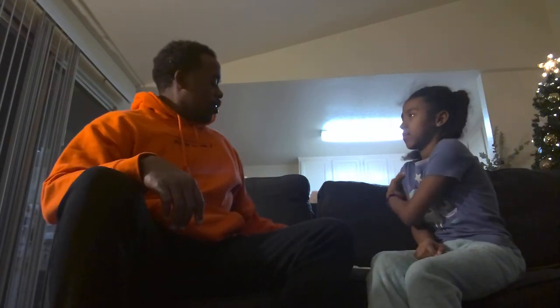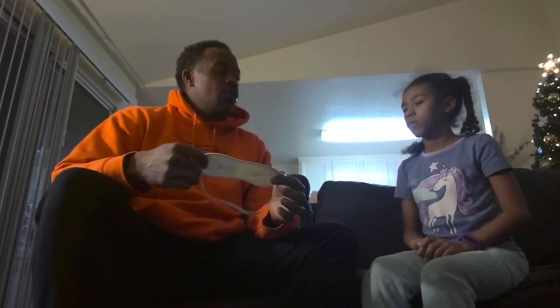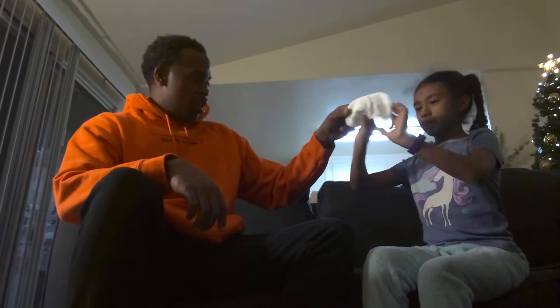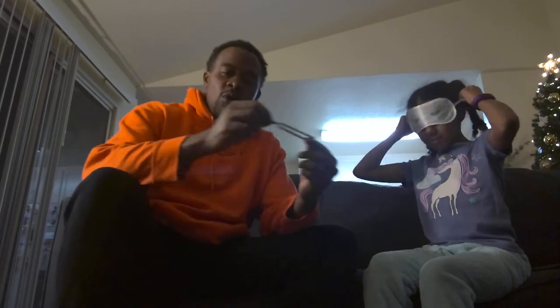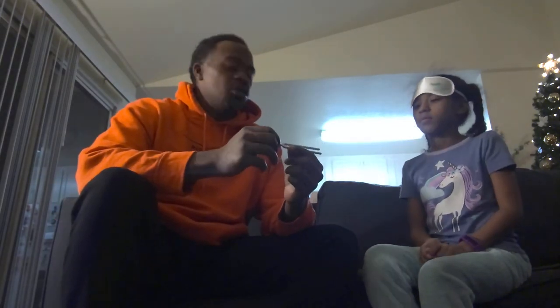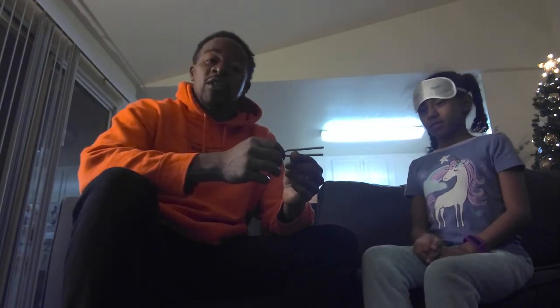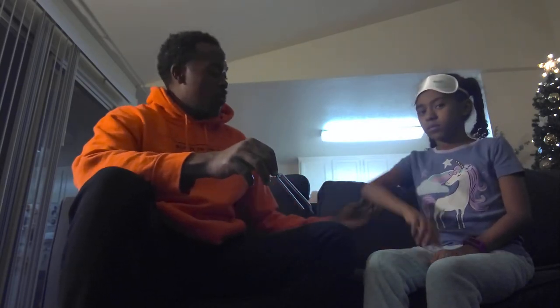Alright, let's get started on some assessments. The first one is the vibration assessment. I need you to go ahead and shield your vision, because we want to use just our senses and not our vision. We're going to use this tuning fork to create a vibratory stimulus. I'm going to apply it onto the olecranon process — the bony prominence right here on her elbow — and we'll see if she can feel that sensation of vibration.